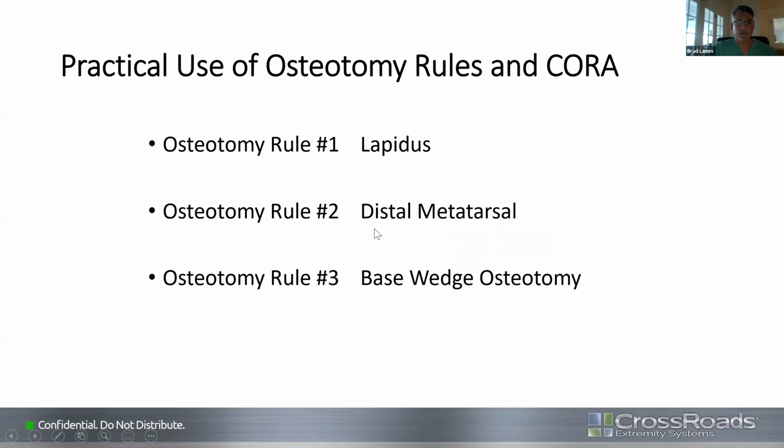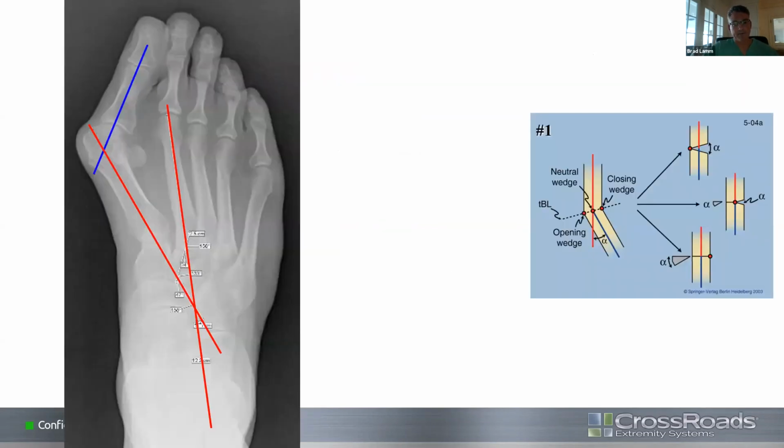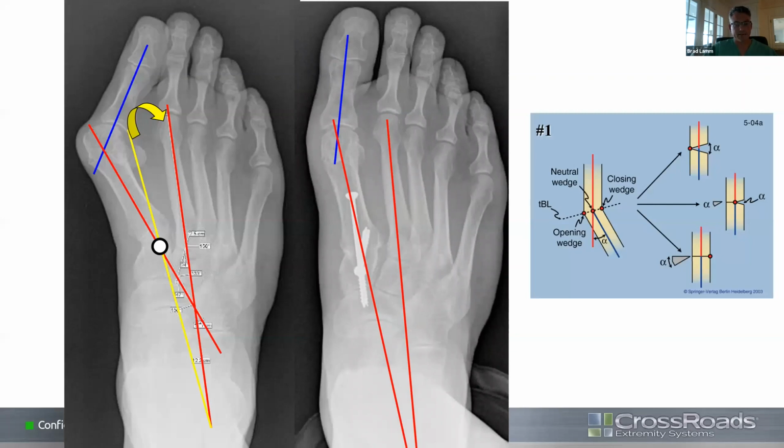The osteotomy rules are important principles along with the CORA, and I'm going to show you how the CORA relates to the osteotomy rules and our correction of our bunions. If you have a bunion as shown here, this would be Osteotomy Rule 1, where you make the osteotomy, or in this case, the Lapidus fusion, at the level of the CORA. Where the yellow and red lines intersect, that's your CORA, which is at the Lisfranc joint. You do your osteotomy and you line up the red line over top of the yellow line to correct your deformity. That's Osteotomy Rule 1, where you osteotomize or correct the deformity at the level of the CORA.